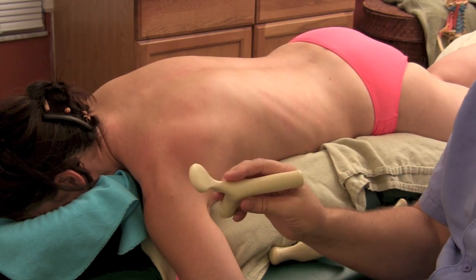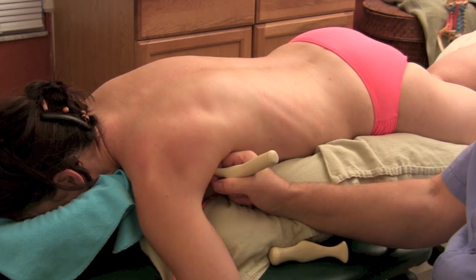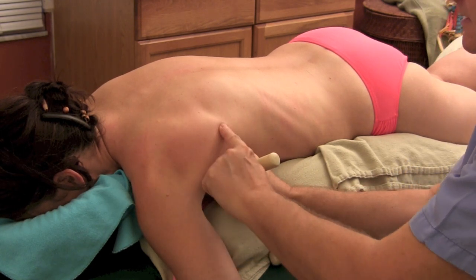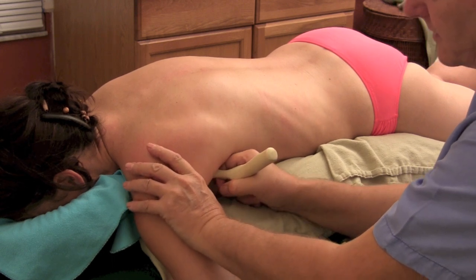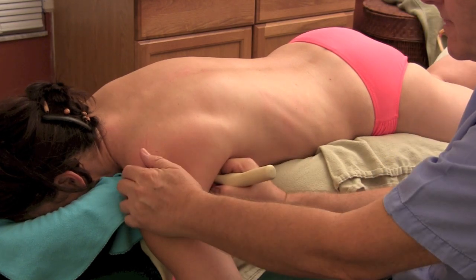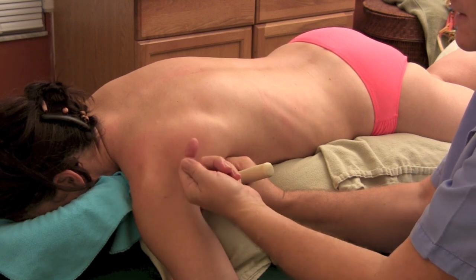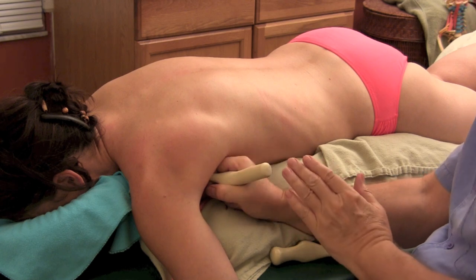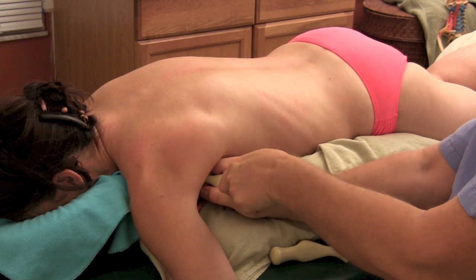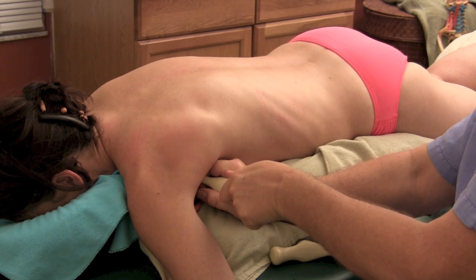That's where the spoonbill tool comes in — it is just a dream come true. You can slide up underneath there just like that, you can bury it. You can see her scapula nicely here, that's why I chose her for this demonstration. You can see I can slide that right up underneath there, and my intention is to push up into there and also put pressure laterally and superior. That's why I made this handle longer — I can use this as a fulcrum to put extra pressure into the underside of the shoulder blade.